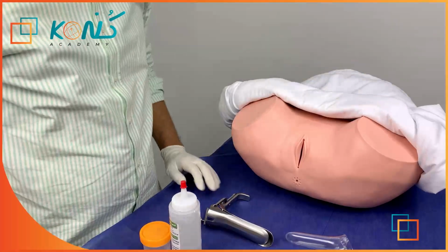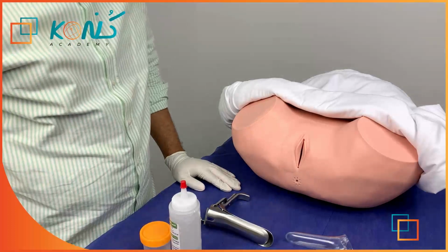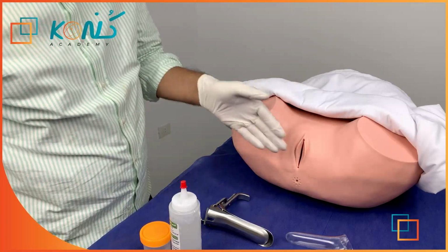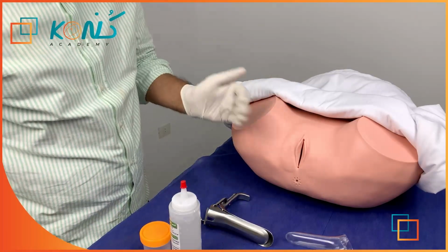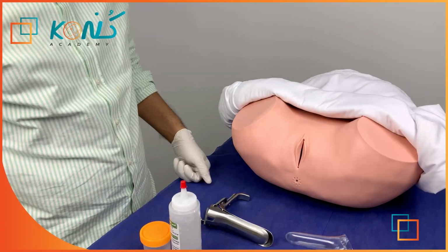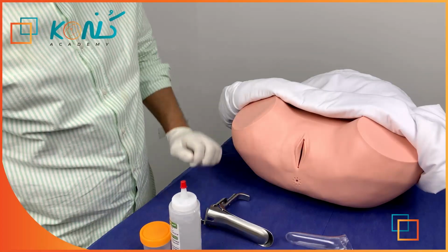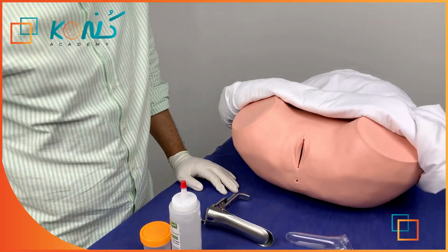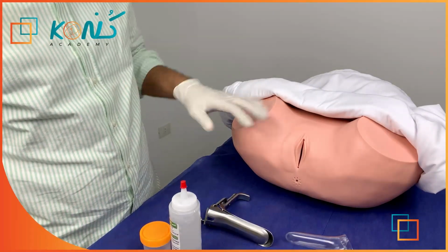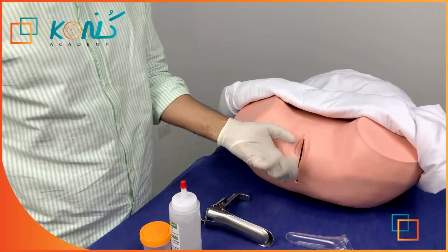Before starting the speculum examination, and after we have ruled out the contraindications, we should have a look firstly. Look for any signs of inflammation, any swelling, any discharge coming out, any cyst. And if you would like, you can also ask your patient to cough for you. Would you please cough for me to see if there is any prolapse, vaginal prolapse I mean, or not. Okay, so firstly, we will have a look for any abnormality, and we'll ask our patient to cough.